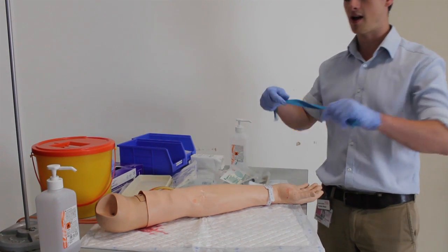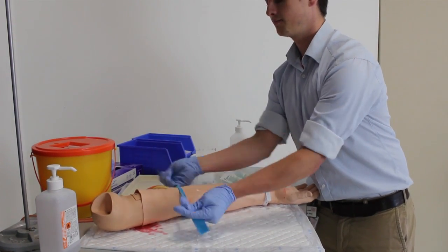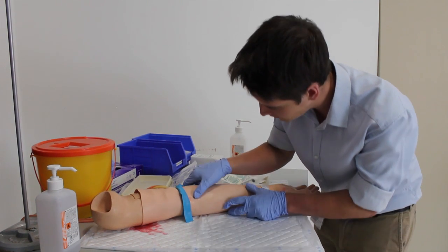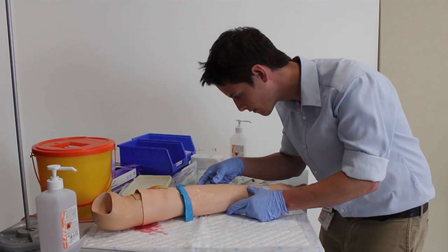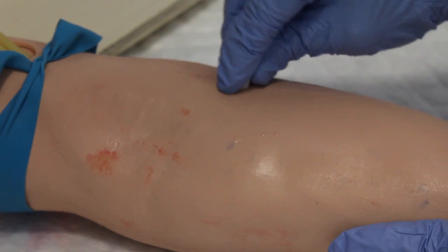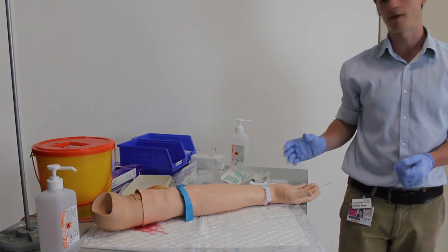You can then approach the patient and attach the tourniquet — tell them it might be a little uncomfortable because it has to be quite tight, but again to let you know if there's any pain at all. Once the tourniquet is attached, you can start to look and feel for a vein that you think might be appropriate for cannulation. Once you've identified one, get out your alcohol wipe and with one single wipe — making sure you're not going over the same ground twice — dispose of it in a bin and then wait 30 seconds for the alcohol to evaporate.